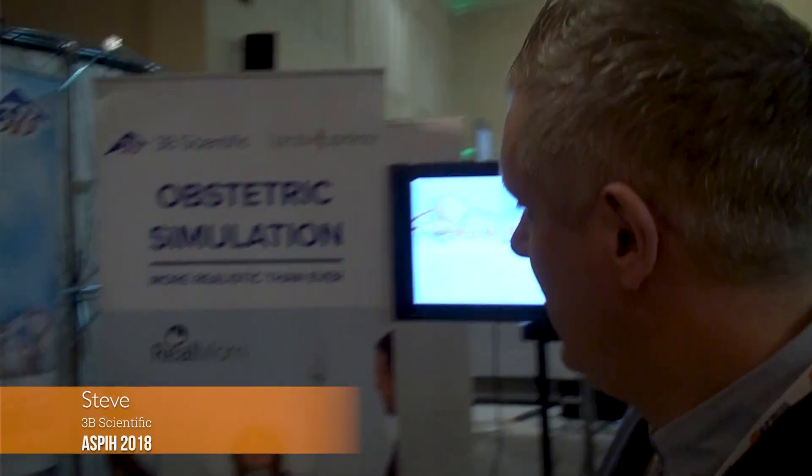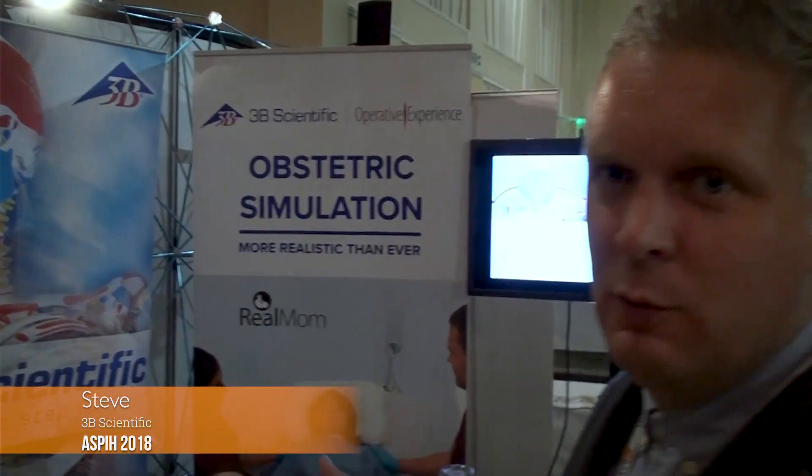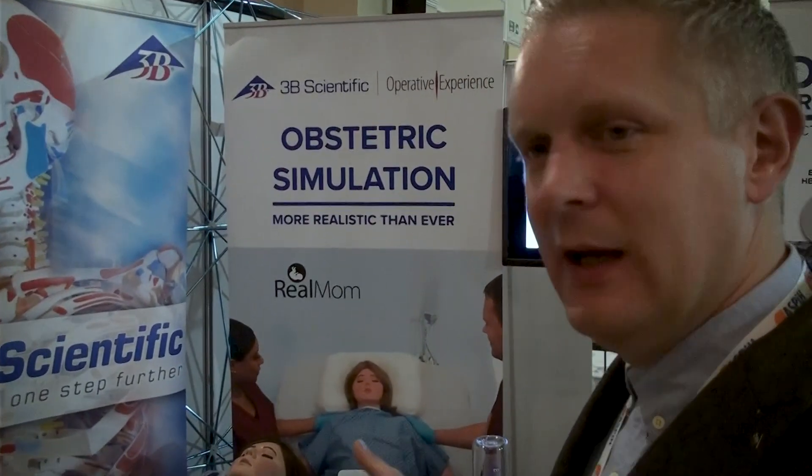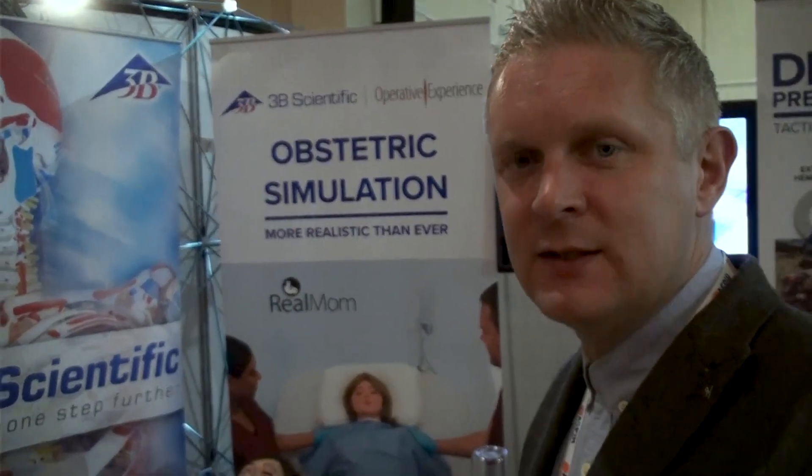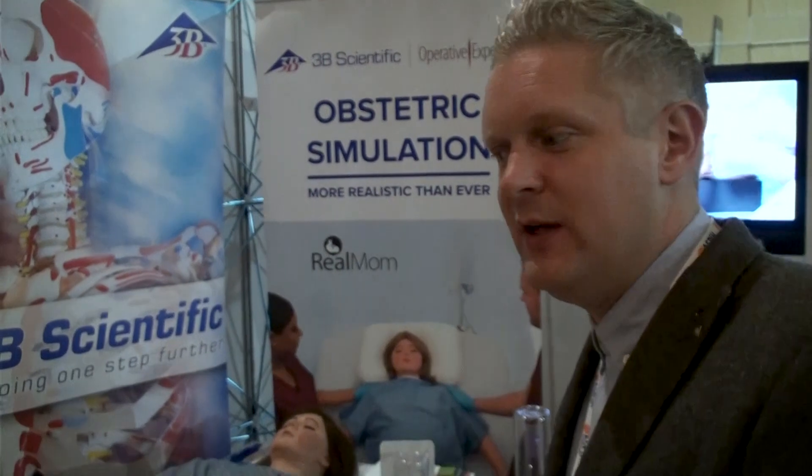I'm from 3B Scientific and I'm going to say a few words about the RealMom simulator. This is made in conjunction with our colleagues over in America at Operative Experience Incorporated.